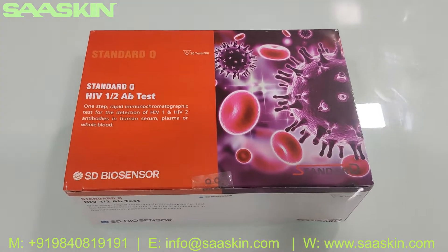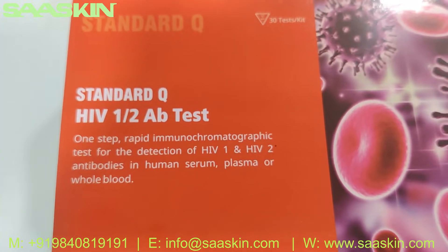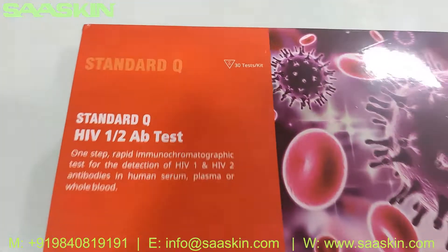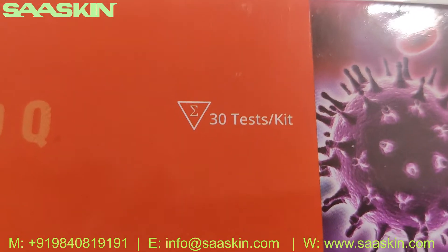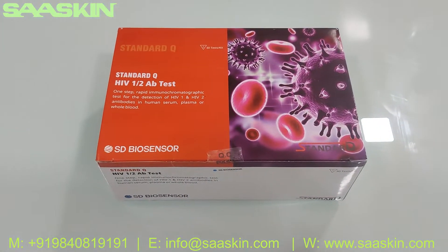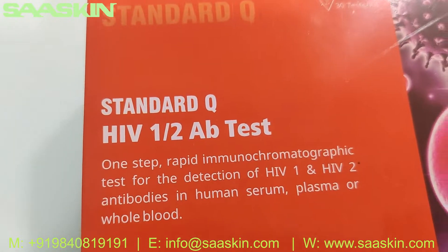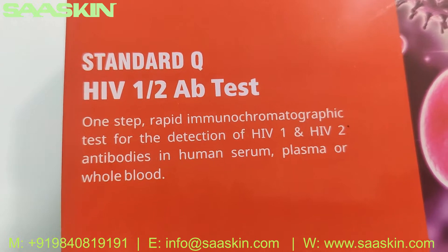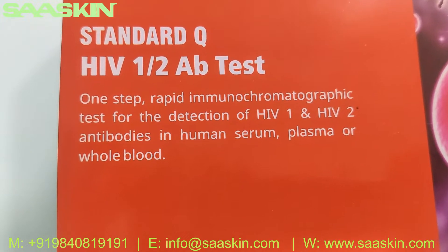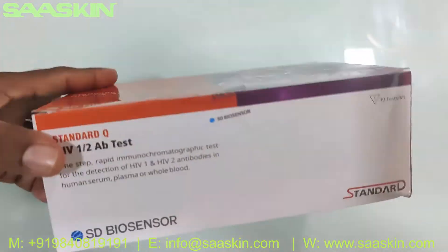Hello everybody, today we're going to see the unboxing of SD Biosensor Standard Q HIV 1 and HIV 2 antibody test kit. It's basically a rapid immunochromatographic test for the detection of HIV 1 and HIV 2 antibodies in human serum, plasma, or whole blood. This is how the total box looks like.